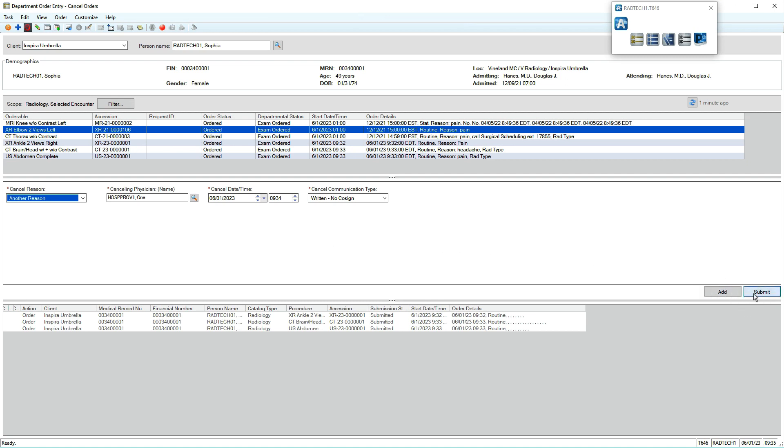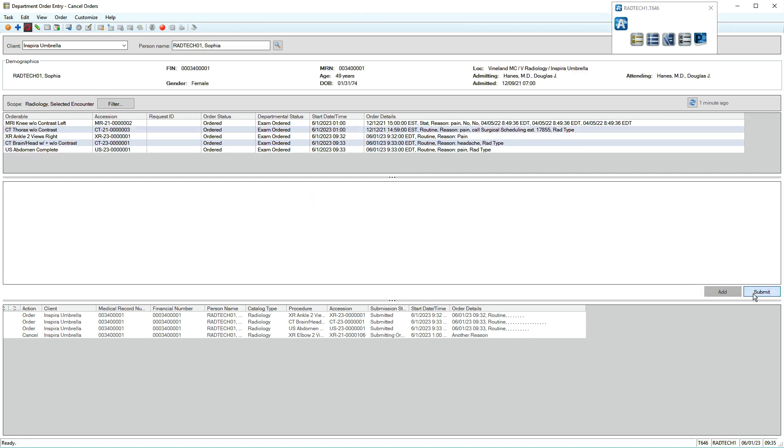Physicians can place inactive orders for patients to complete within a specified timeframe. When patients present for these exams, you'll activate the order to associate it to their current encounter.